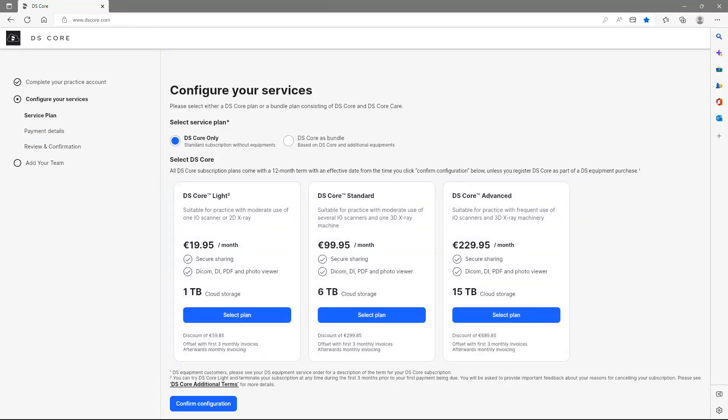If you have purchased DSCore as bundle with PrimePrint Solution or PrimeScan Connect Solution, please choose the second option. All subscription options of DSCore include connectivity to your DS equipment for automatic upload of files, so you can build your patient media library on the cloud.